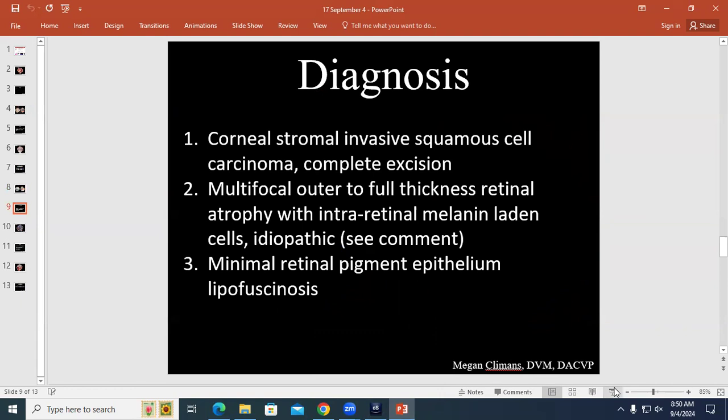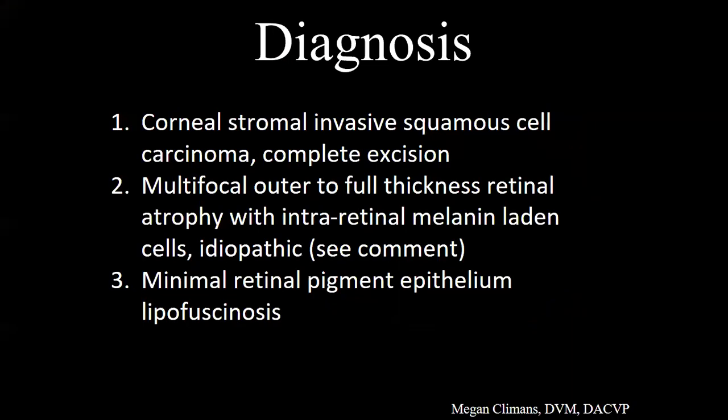All right. So the main diagnosis, corneal stromal invasive squamous cell carcinoma. And some interesting things in the back of the eye as well. All right, I will shift. That is my last case.